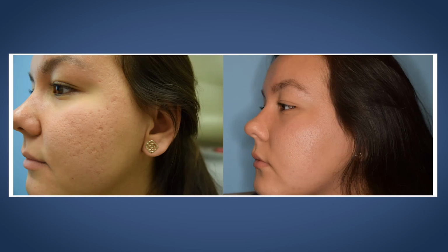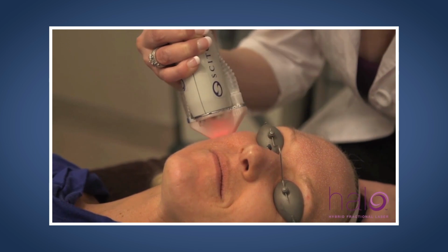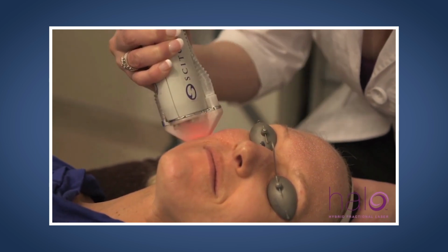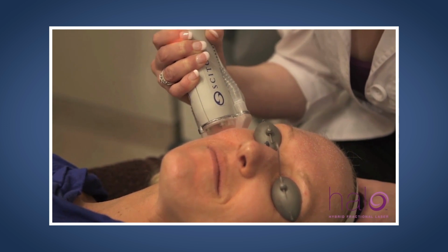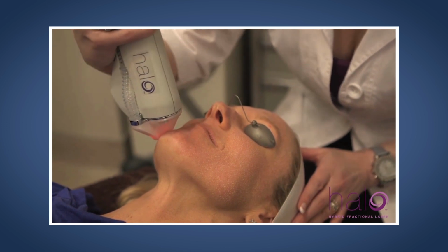And for her, wow. All right, so this is Halo alone, 2 sessions of Halo alone. Really at maximal settings. So at 700 on the 1470 and then 40% density. You can't really go too high on the 2940 once you've got that much energy going into the 14. Right. But I think she had maybe 20 or 30 microns of ablation. I was blown away. It was kind of, let's try this. Let's see what the Halo can do. And since then, Halo has really become one of my go-to treatments for this atrophic acne scarring.